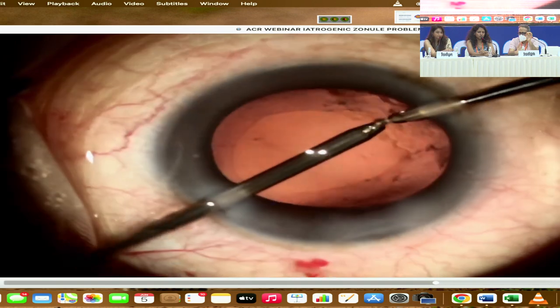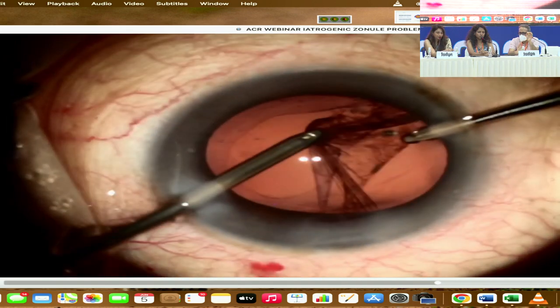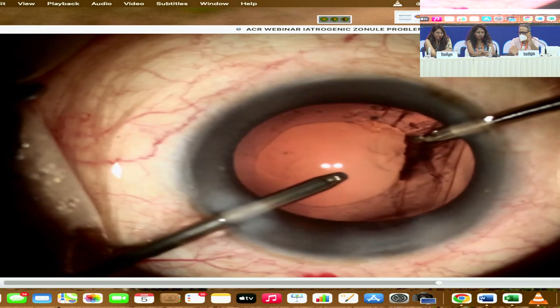See, this is what happened. So you were able to release it? Yes. The moment you were able to release it, you move forward slightly. Now at this point of time, the bag has not to collapse. So the visco has to go in somehow so that the bag gets inflated and that area goes back. You can take out the aspiration port and put the visco somehow inside.